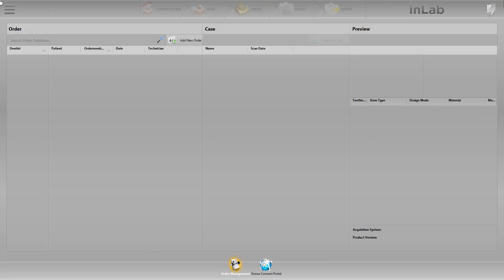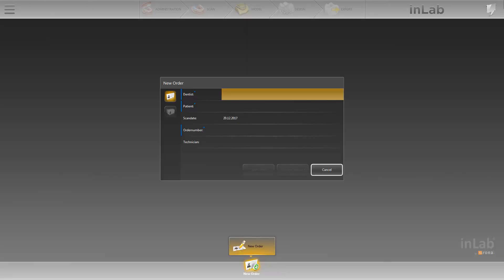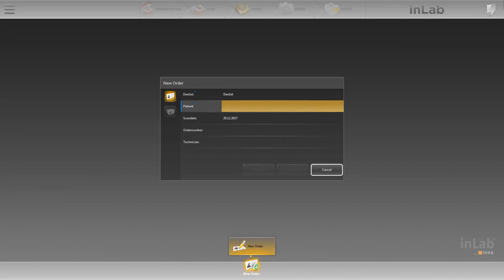First, we'll create a new case. To do this, click on Add New Order. A new window opens. We enter the name of the dentist and the name of the patient. These two pieces of information are all that is required to create the case. Further information is optional. We can now click on Save and Add Case.